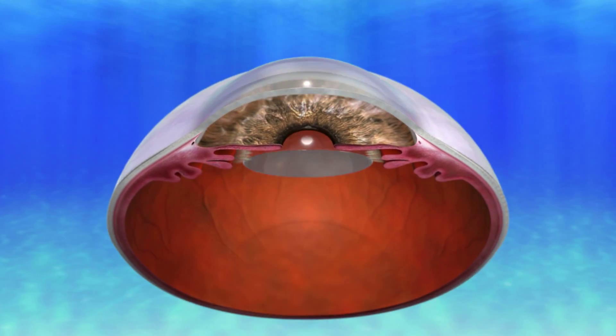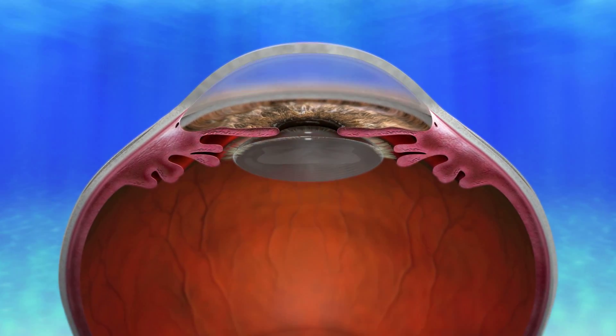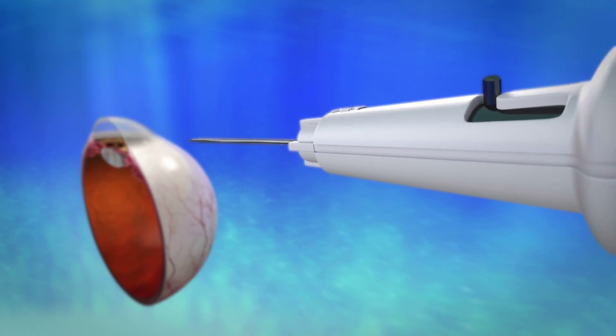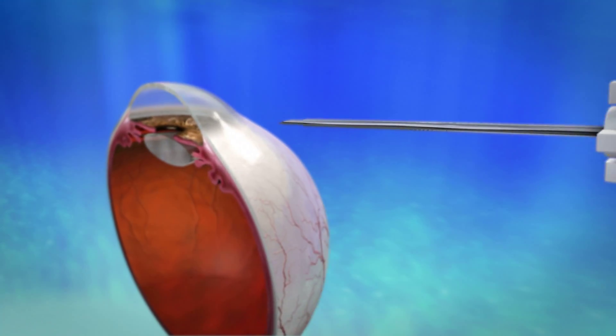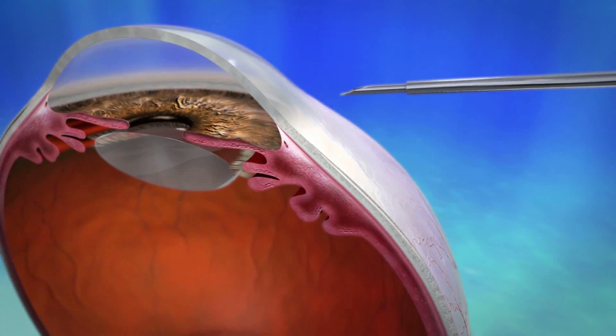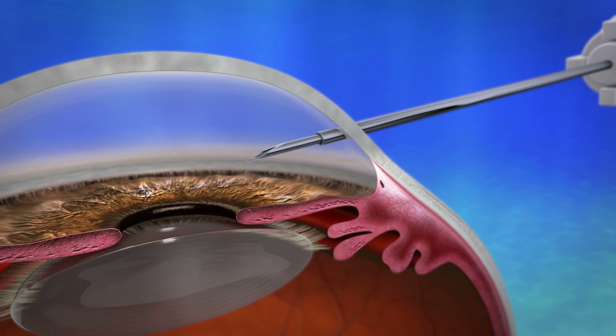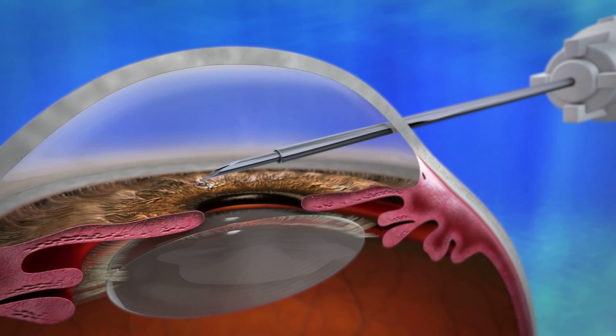A sub-2-millimeter clear cornea main incision is recommended for the procedure. The injector enters the incision and travels across the eye to the superior nasal quadrant where the stent will be placed. Due to the ab interno approach, the gel stent is placed properly away from the iris and endothelium.